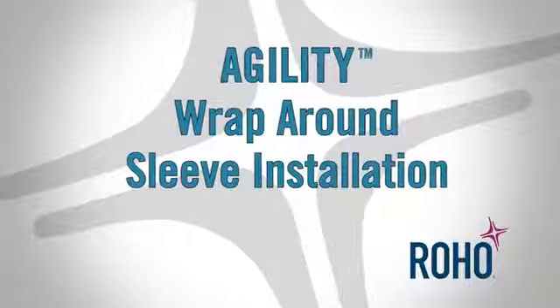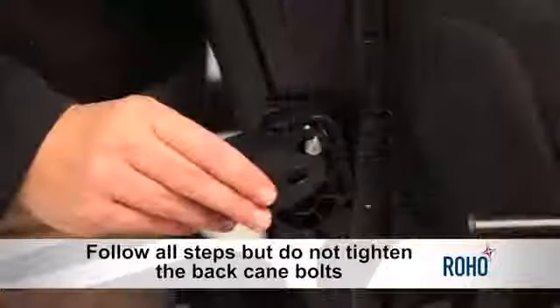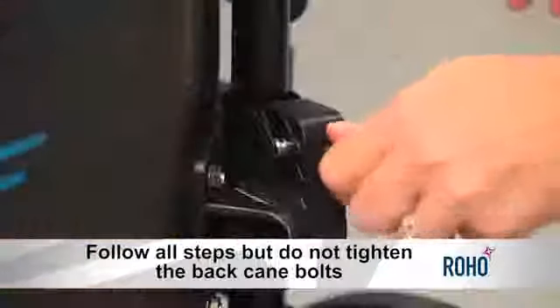In some cases, you will need to use sleeves to properly install the Agility fixed hardware if the wheelchair cane diameter is 3/4 of an inch, but less than 1 inch. To attach to these types of chairs, you will follow all wraparound steps, but will not tighten the bolts after the back cane bands have been attached to the wheelchair.